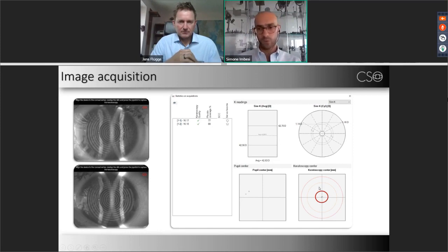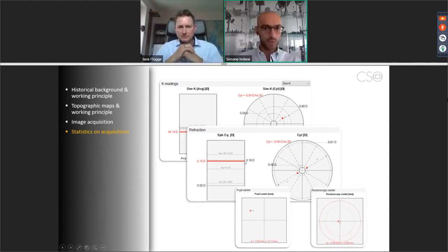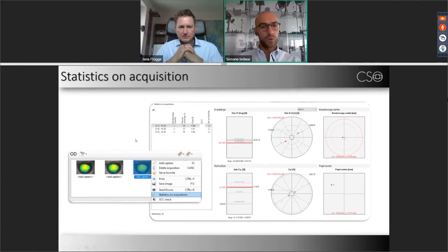Okay, so let me use this slide to introduce this kind of report that you can get after all your acquisitions. Just going in the gallery over one acquisition and right clicking, you can get access to the statistics on the acquisition. This is, in my opinion, a complete panel that gives you all the information that you need before opening an acquisition to understand if the acquisition is good or not.